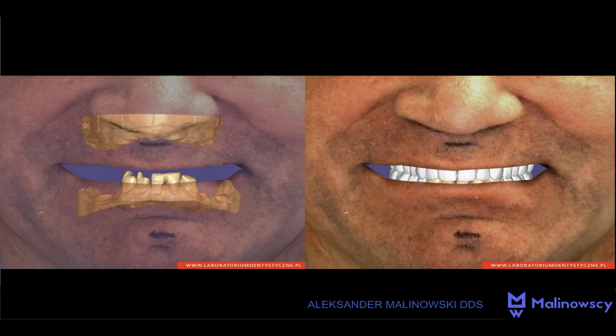Having the spatial positioning of the models, we conducted a diagnostic waxing which we showed to the patient. Ultimately, the design was modified due to the teeth being set too narrowly, causing the impression of black tunnels in the lateral part of the smile. Here you can see these tunnels. It was our fault.